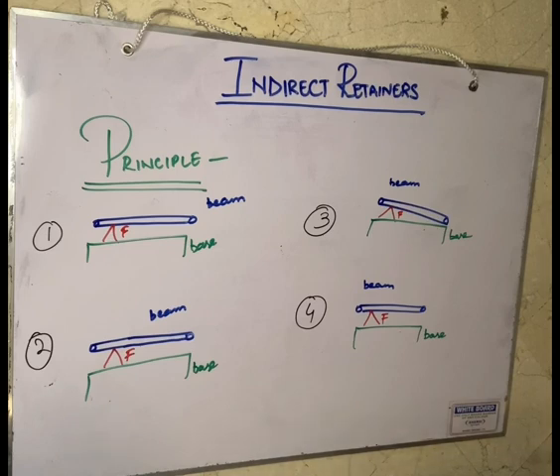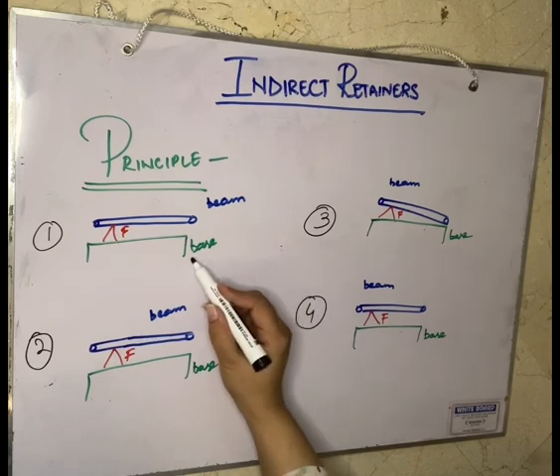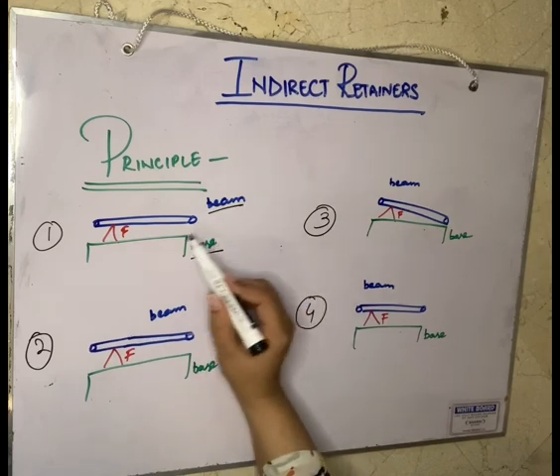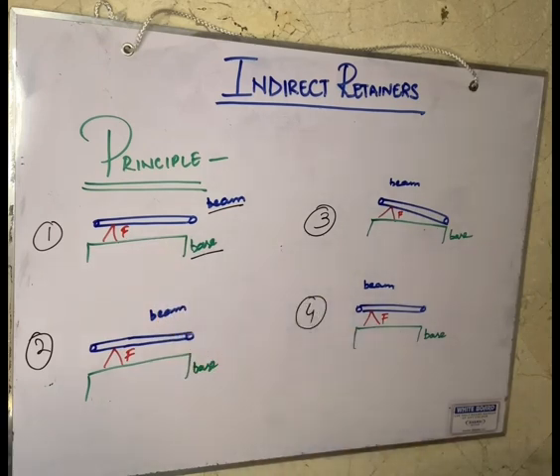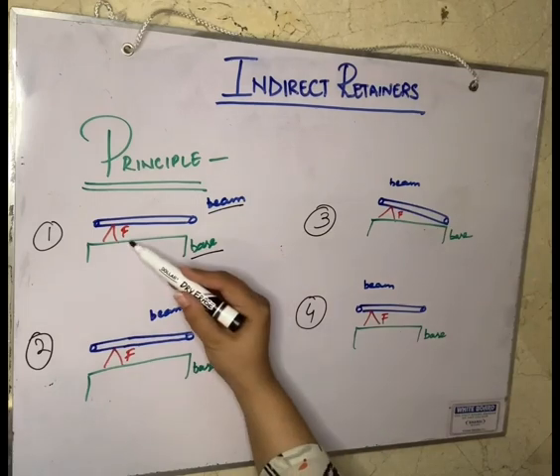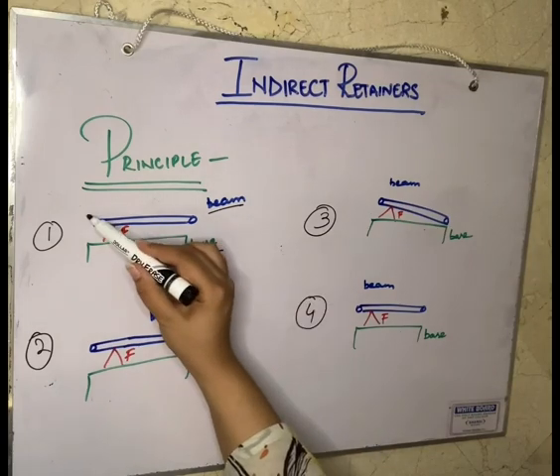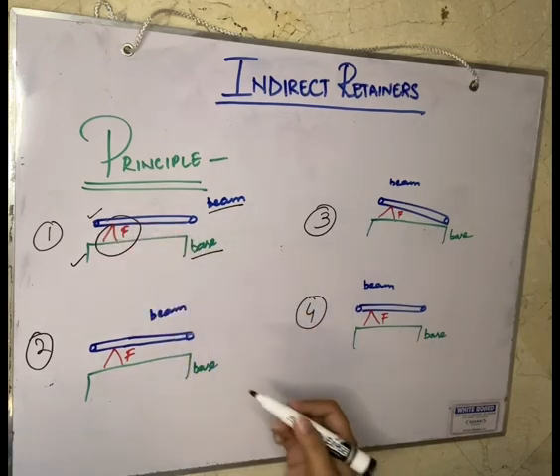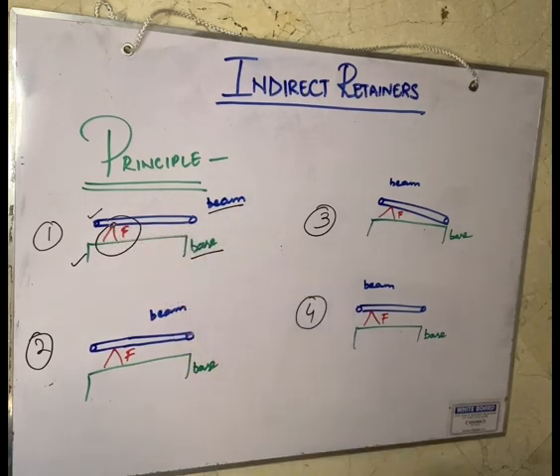So, here we can see a figure in which there is this base. This green part is the base, the blue body or beam, and this red part denotes the fulcrum. So the fulcrum connects the body to the base. The beam to the base is connected via the fulcrum, and the fulcrum is the point where the body will move or displace.